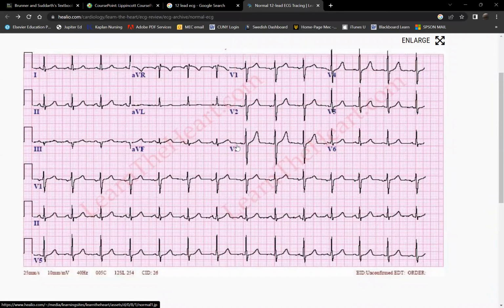Imagine this in a way wherein there are 12 different photographers taking a picture of the electrical conduction of the heart from a different vantage point. Does that help? Meaning each of these photographers are sitting on a different pedestal around the heart. Will they give you different pictures? If there's a photographer over my left shoulder, another from my right shoulder, all taking the same picture of my heart, will they give you the same pictures?